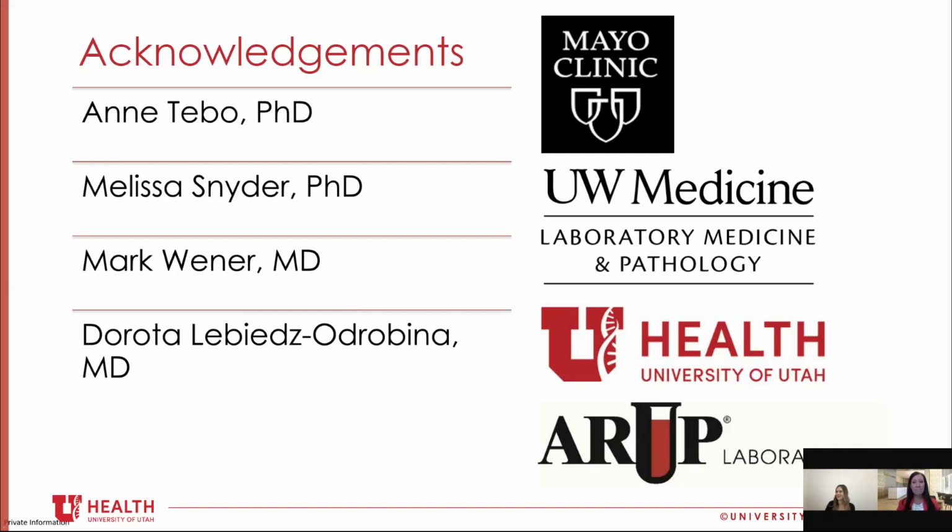Great, thank you. All right, well, looks like we have time for one more question here, so we'll wrap up after this one. This final question asks, does all low anti-RNP titer results need to be confirmed by different methods? I would say yes. At this point, if it's an RNP specific protein that's used as the antigen, in order to consider that associated with mixed connective tissue disease, you would need to either have a high titer speckled ANA pattern or a high titer or at least positive anti-Smith RNP.